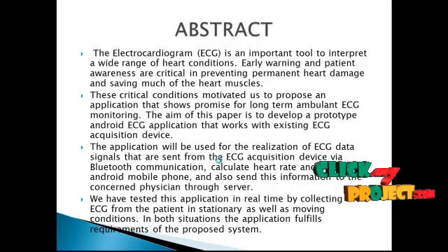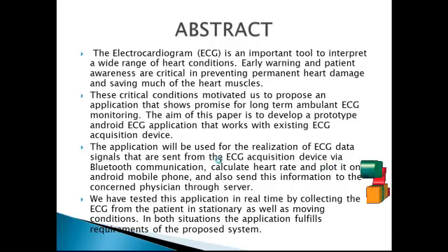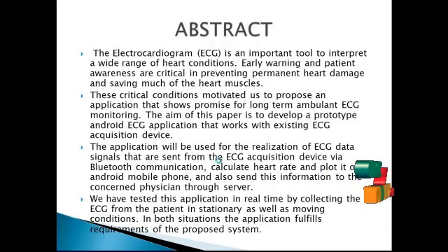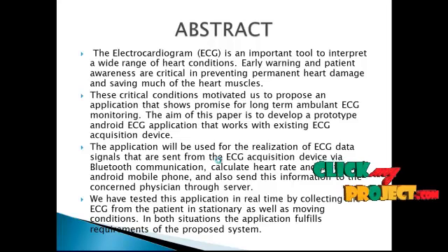First, in the initialization of communication with the ECG system, this module is involved with the settings of the communication with the ECG device using the Android Bluetooth API. It identifies the mutual recognition between the device and the receiver, sending acknowledgement to the hardware.